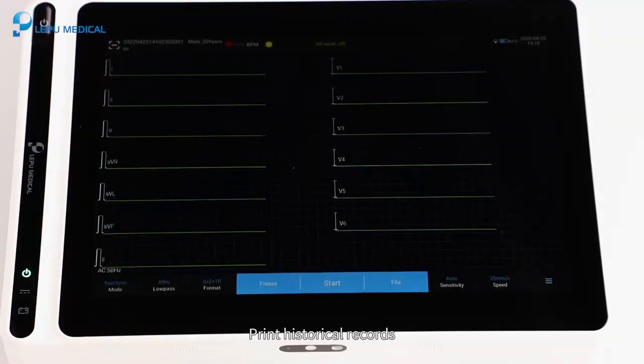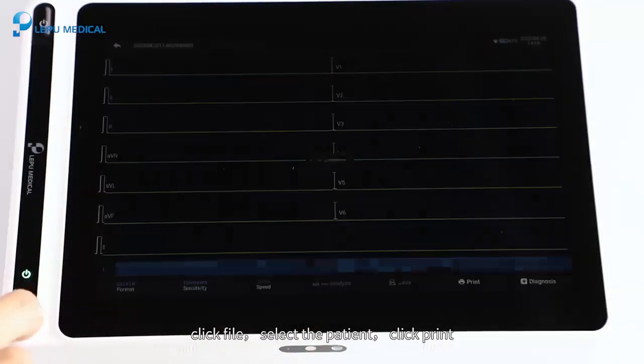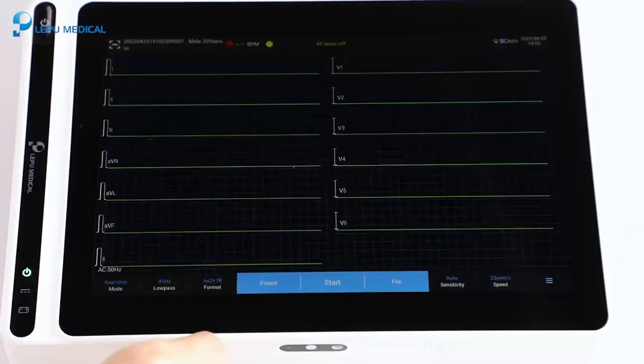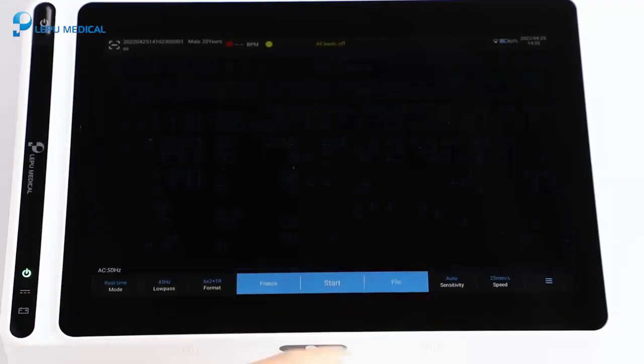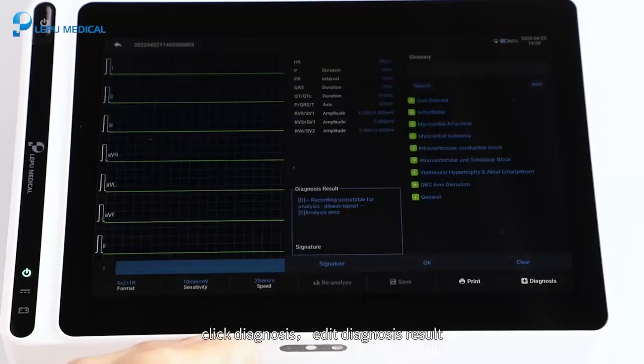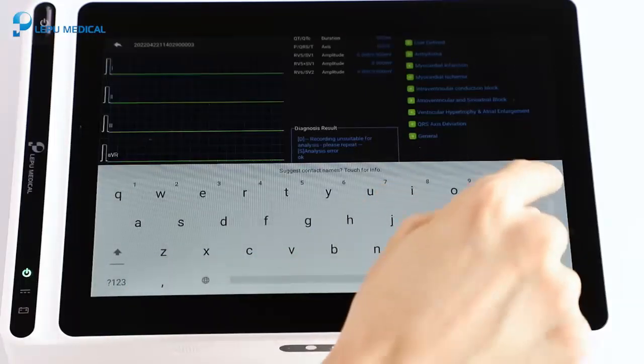To print historical records, click File, select the patient, and click Print. To edit a diagnosis, click File, select the patient, click Diagnosis, edit the diagnosis result, and click OK.